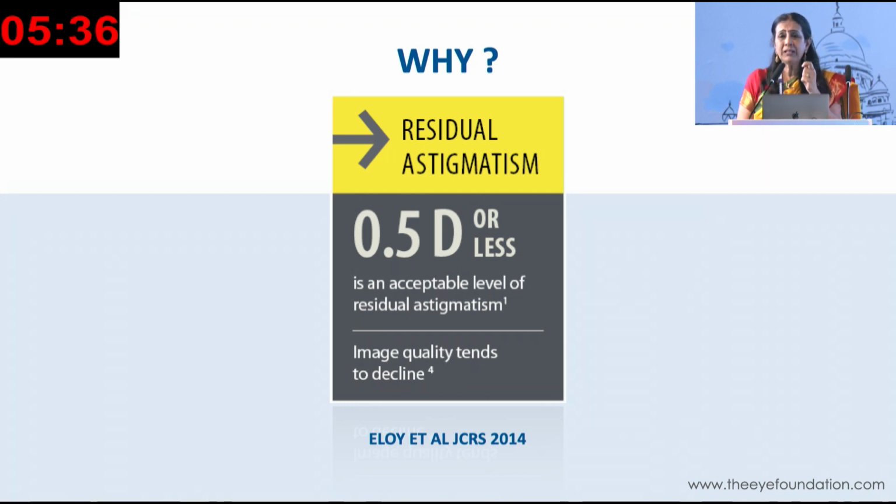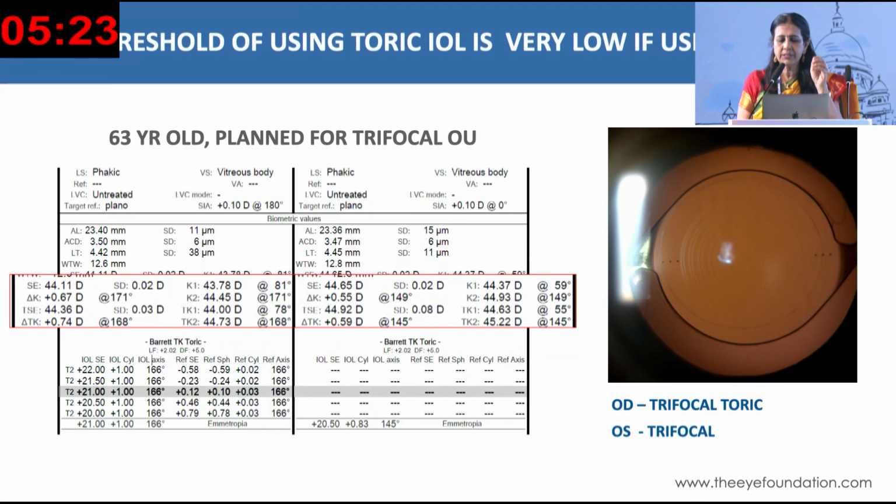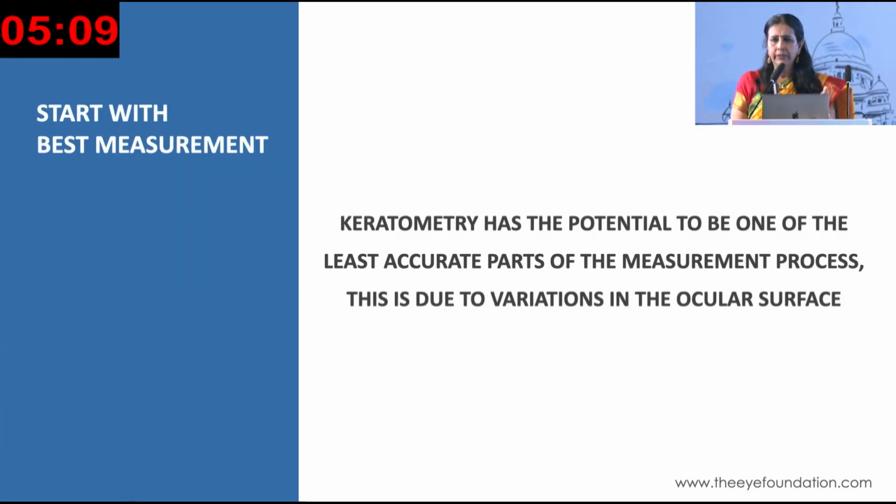Now, why am I insisting on astigmatism correction? Even more than 0.5 diopter astigmatism, the image quality declines if it is not corrected. So if you want that precision in image for your patients, you need to take care of that. And it becomes even more important in premium multifocal IOLs, where even if the astigmatism is just 0.75 diopters, it has to be corrected. And if it is against-the-rule astigmatism, even 0.75 could be treated with a toric IOL.